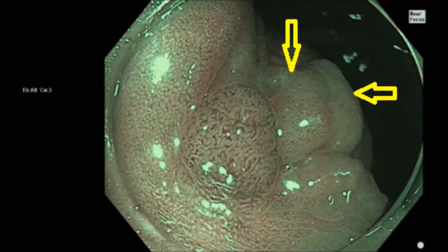A few things worth noticing here. First, there are a couple of mounds of clip artifact type 3, completely mature, non-inflamed clip artifact, designated by the yellow arrows. And the pits that are on this type 3 clip artifact are the normal tiny white pits of colonic mucosa. They're identical to this normal fold that's seen in the upper left of the image and marked with the red arrows.